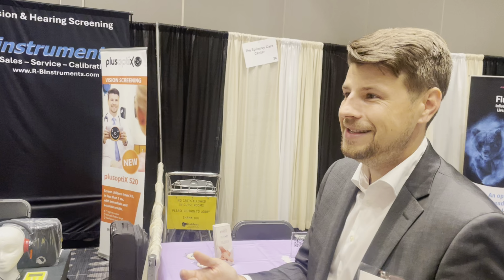Purpose of vision screening. So far, pediatricians do visual acuity testing. Before visual acuity testing, there's only one test they can do, and that is red reflex testing. Red reflex testing is when they take an ophthalmoscope and shine light into the eye and get a red reflex, and they try to see if the red reflex has a different color in both eyes or has a brightness pattern from almost white to dark. This is indicating refractive errors. This is what they do with babies.